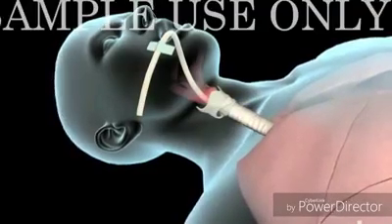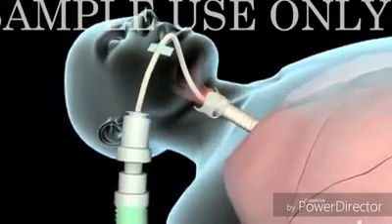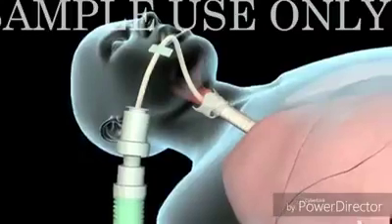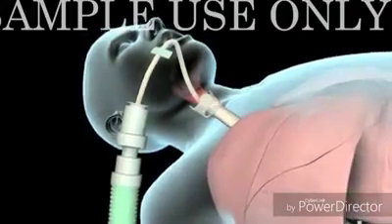Now, finally, after removing the ambu bag, you are supposed to attach the endotracheal tube to the ventilator. This is how the process of intubation is done.